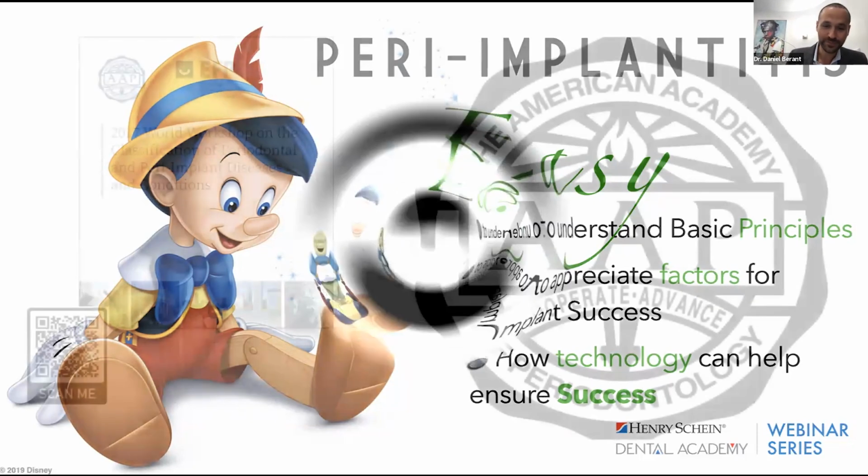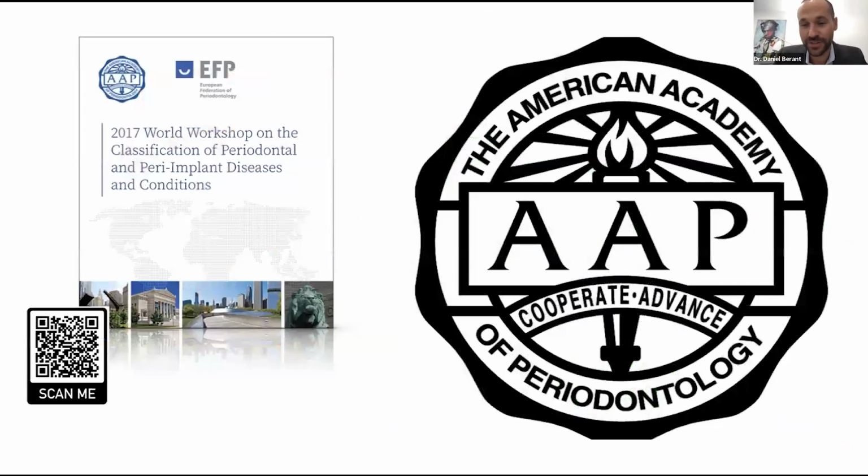So as I was introduced, I'm a double board certified specialist in both periodontics and orthodontics. And for those of you who know the world of perio, we love our classifications. And relatively recently, in 2017, the European and the American Academy of Periodontology came together and formed this world workshop. If you scan that QR code, it'll take you to the main page where you're able to have access to all the papers that they publish that is available to all of us professionals and patients.